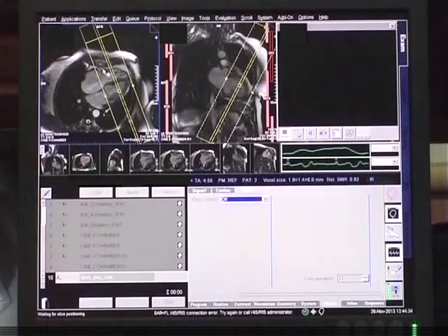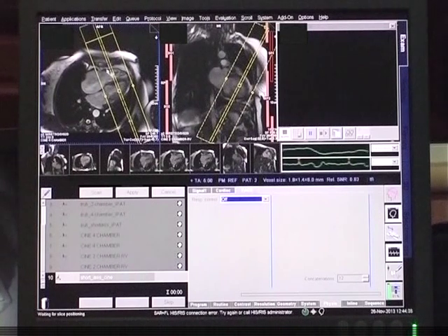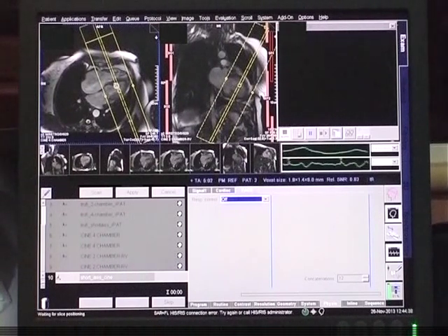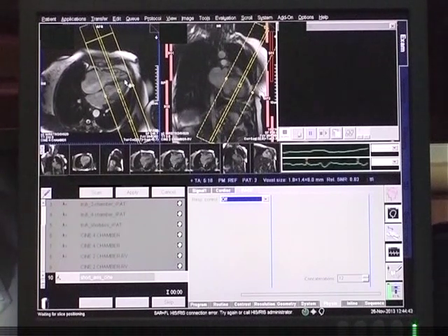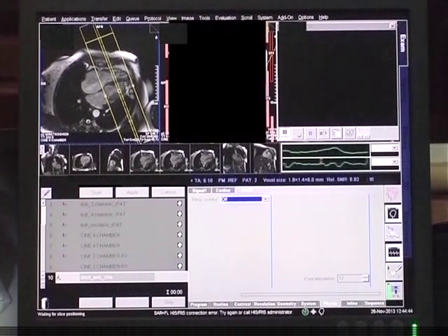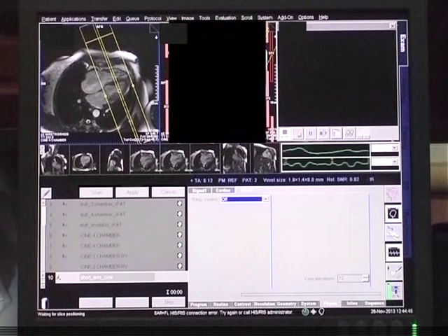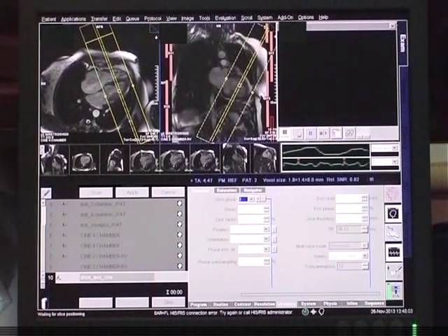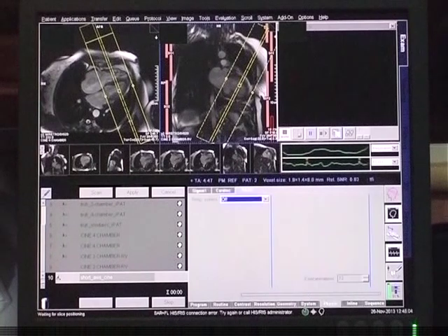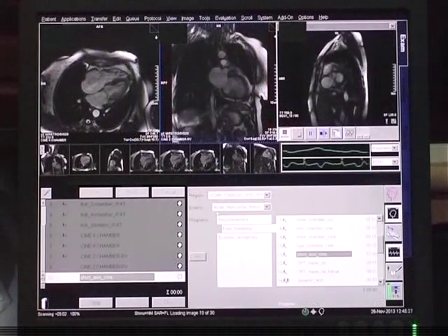For the true short axis, lines are drawn perpendicular to the interventricular septum. Slice thickness is six millimeters and ten slices are drawn from the base to the apex.